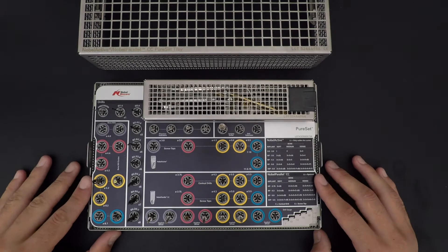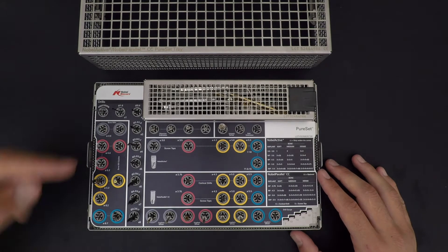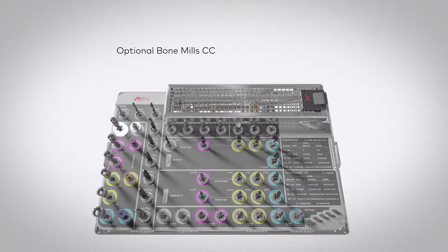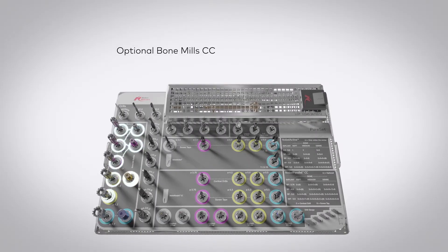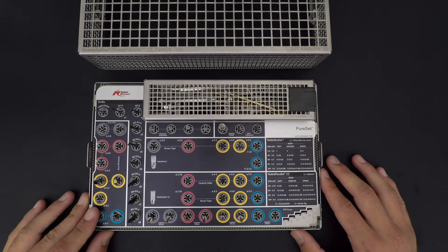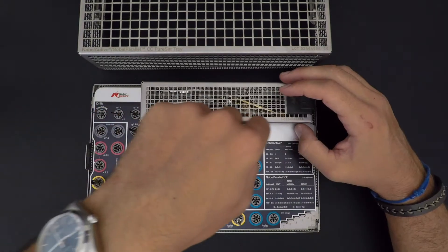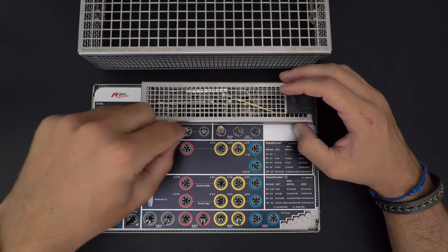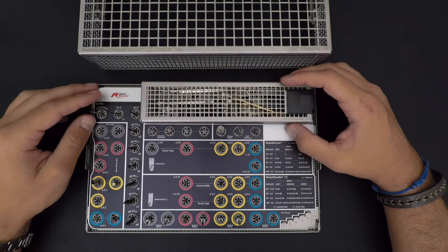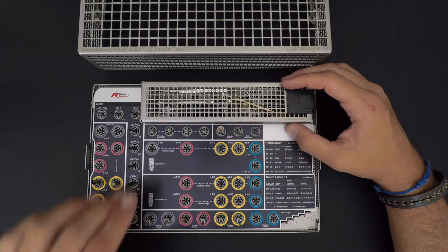Next to our drills, we got our bone mills. You can see my set is not full - it's a demo kit so I'm not supposed to use it. At the bottom here are all of your tools that come with a Pure Set. None of the drills are included, but all of these are.